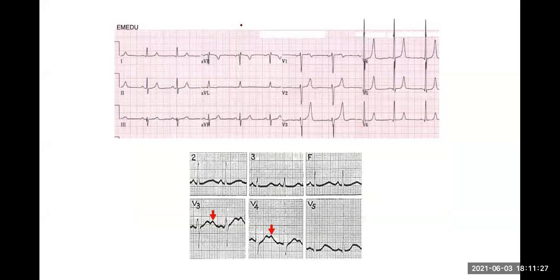Right. Okay. Now the last part. So we have talked about the P wave, we have talked about the ST segment. Now we are talking about the T wave. A T wave, as you know, can be inverted. Fine, you already know that. I'm not going to show you a picture of that. But in this T wave, you can see another abnormality, which is quite obvious. This is a tall tented T wave. So in the T wave, what you're looking for is essentially a tall tented T wave of hyperkalemia.